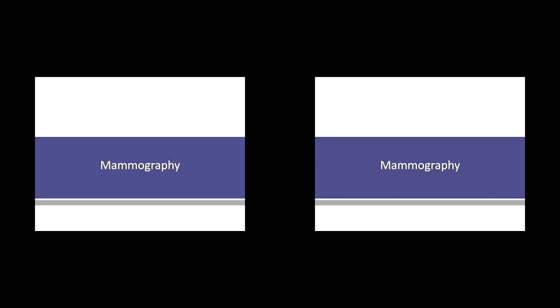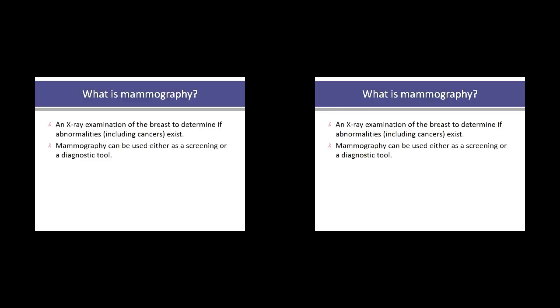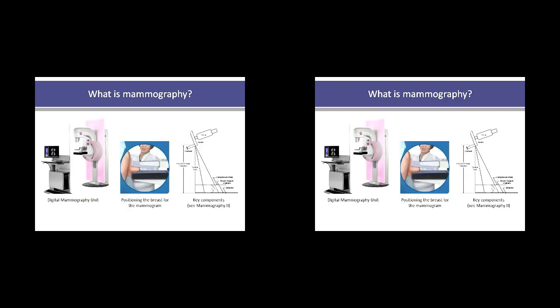So we'll look now at mammography. What is it? People often just say it's any form of breast imaging, but strictly speaking, the term mammography does refer to the X-ray examination of the breast, which obviously we're doing to determine if abnormalities, including cancers, exist. You probably link it with breast screen, but it can also be used as a diagnostic tool. So if a woman has presented to her GP with what she suspects is a breast lump, she'll be referred on to mammography as the first port of call, and they'll use that then to diagnose whether that's the case.